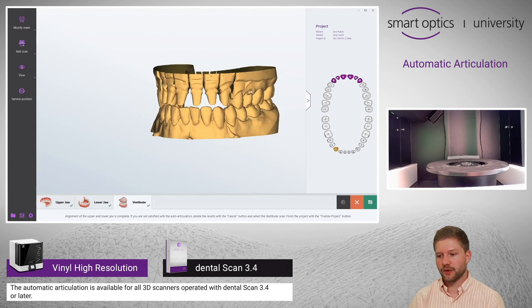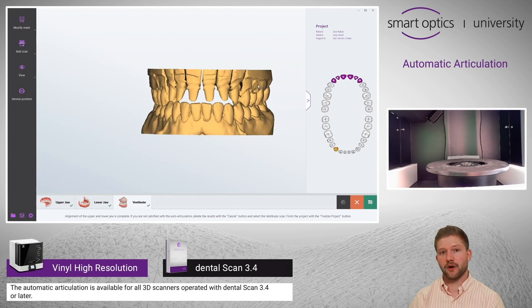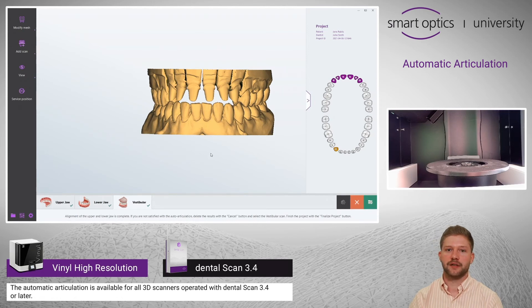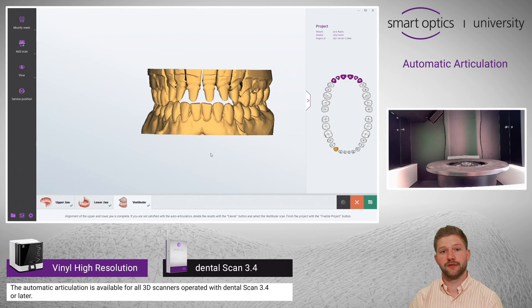If you want to repeat the auto articulation, just click on this button. You can then start the automatic articulation, or you can even start a normal articulation scanner.